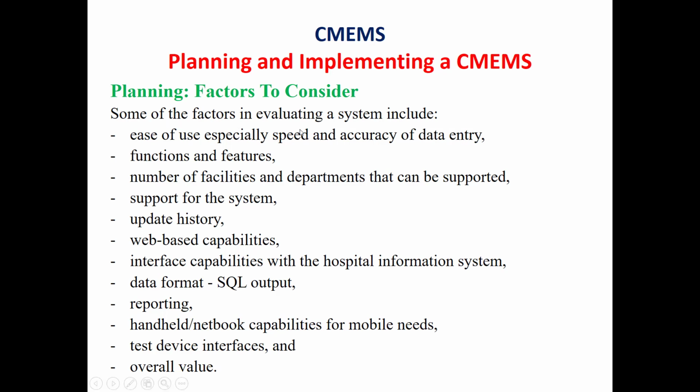Some of the factors include ease of use, especially speed and accuracy of data entry. Another point is the functions and features, the number of facilities and departments that can be supported by the system, update history, web-based capabilities, interface capabilities with the hospital information system, as we said before, and the data format, the SQL output.